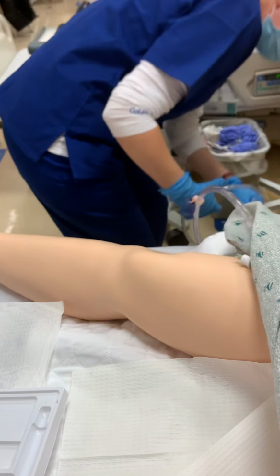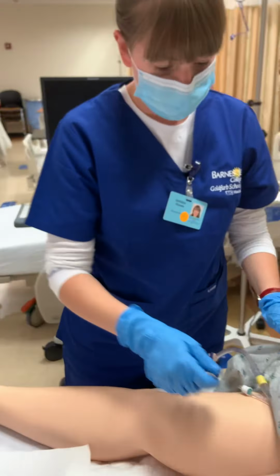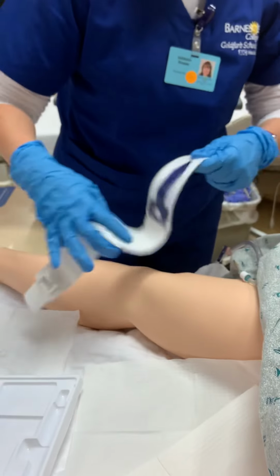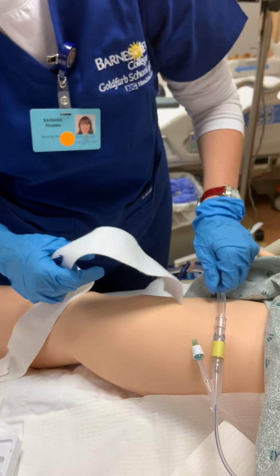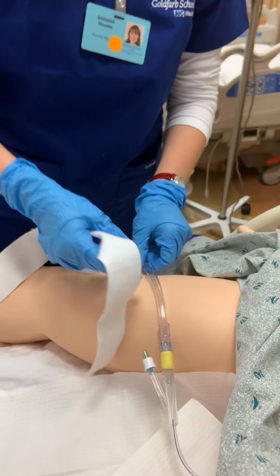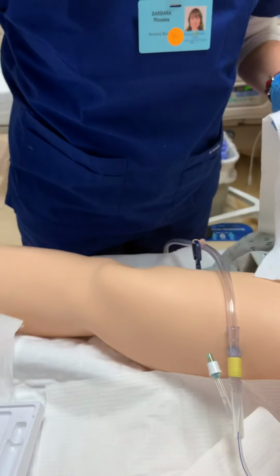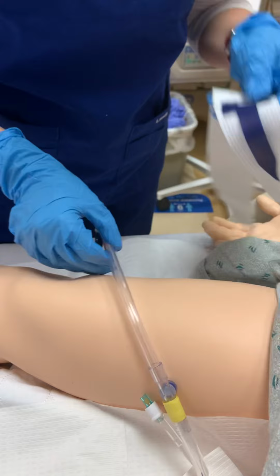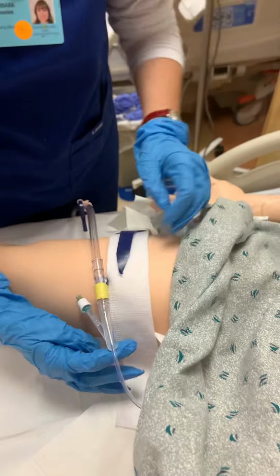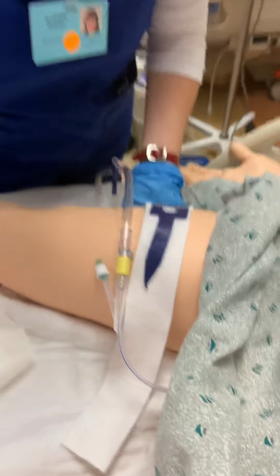Hang this back over here on the side of the bed that does not move. And I will also attach this. Now I'm going to make sure to give it some slack. That way, in case you move at all, it shouldn't pull. Okay, thank you. You're welcome. The skin looks good in the area on the thigh here where I'm going to attach this. I'll be checking it periodically, but please, if you feel any irritation or it just doesn't feel comfortable, let me know. Thank you. Certainly don't want you getting any sores there from it.